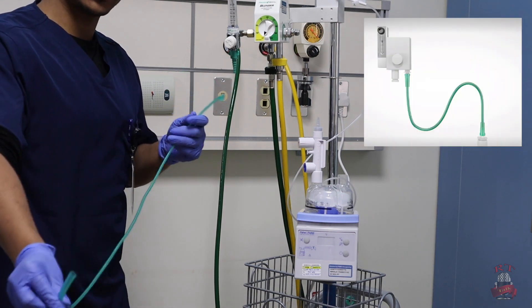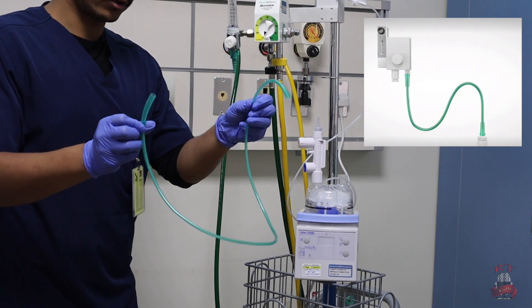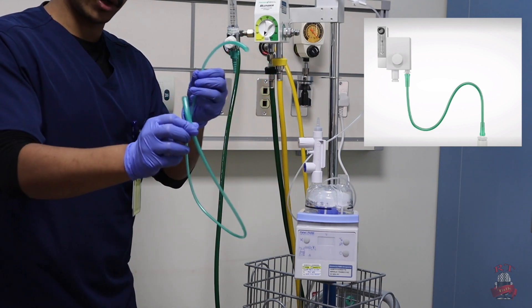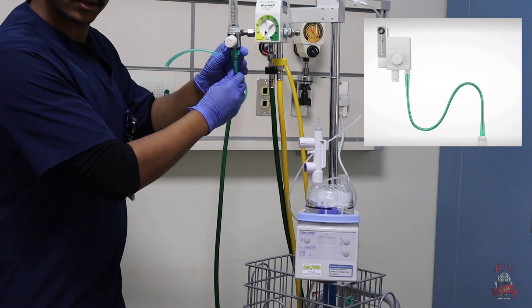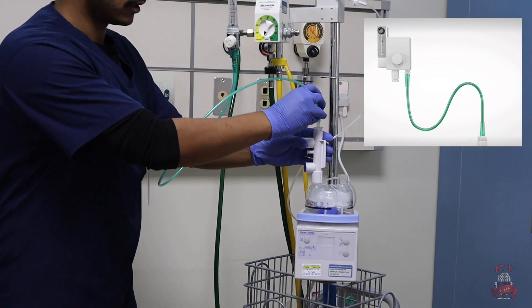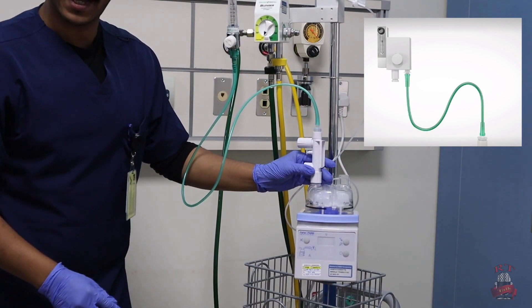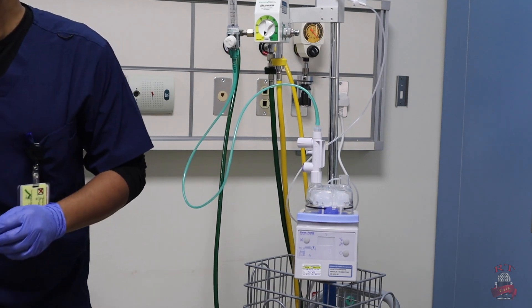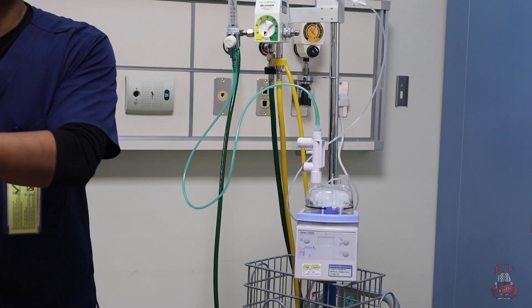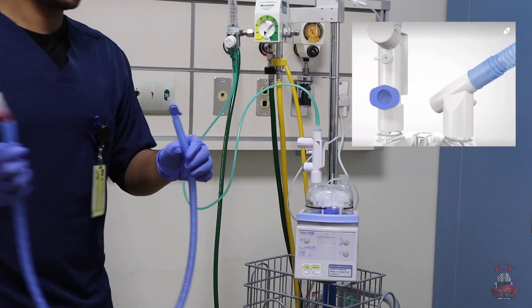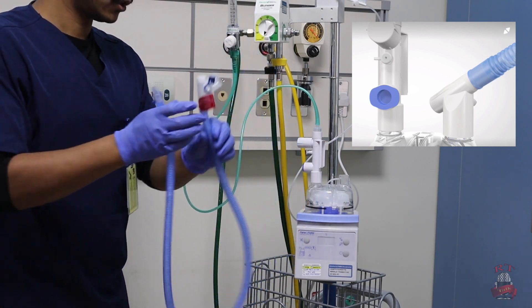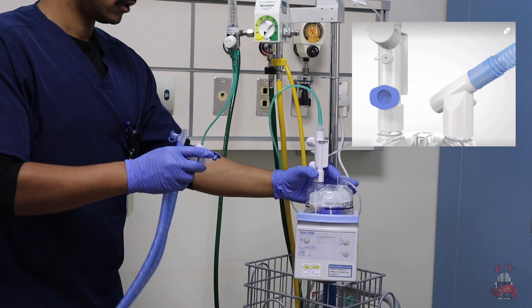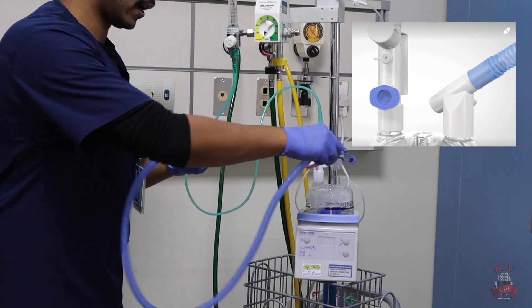After that, you will take one meter oxygen tube or green oxygen tube. It's enough, one meter. You will connect it between your flow meter and your pressure release valve. After that, you will take now your inspiratory limb, the blue one. Then you will connect it on the other side of the humidifier.